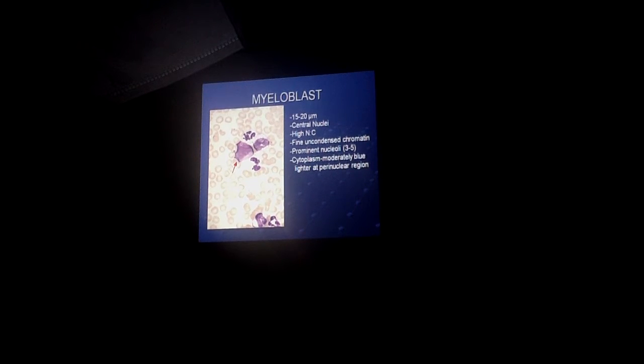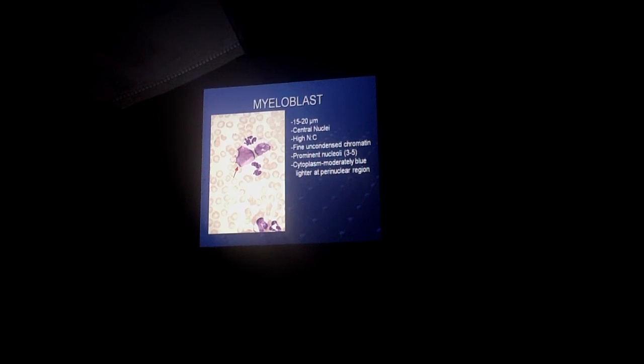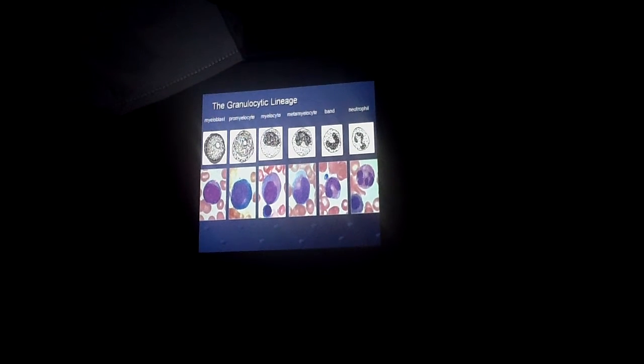So yung mga whites na yan, those are actually the nucleoli of the myeloblast. So the nucleoli can number as high as 5. So normal range is 3 to 5. Itong blast na yan, mayroong 1, 2, 3 nucleoli. And then the cytoplasm will have a very light color. So those are the characteristic features of a myeloblast. Walang granule sa kanyang cytoplasm.